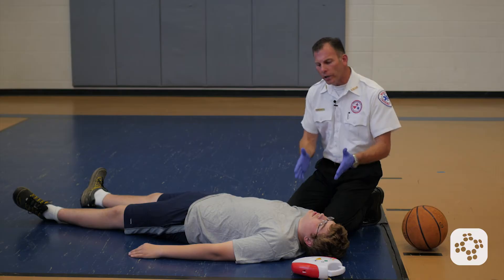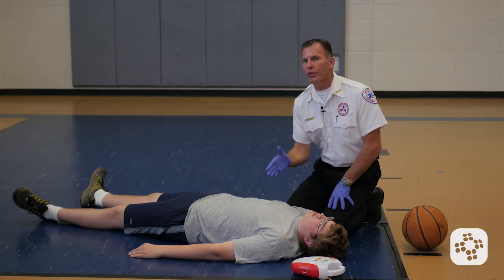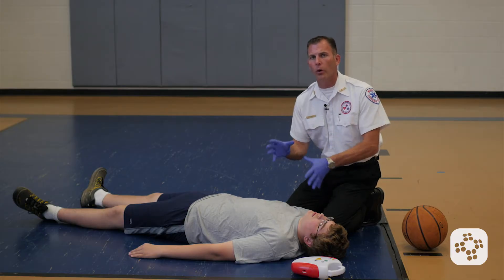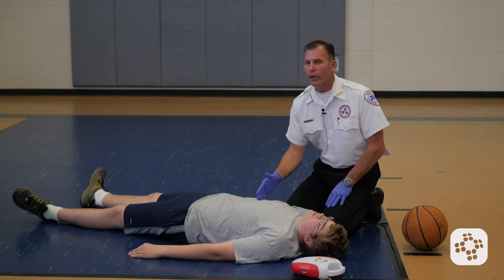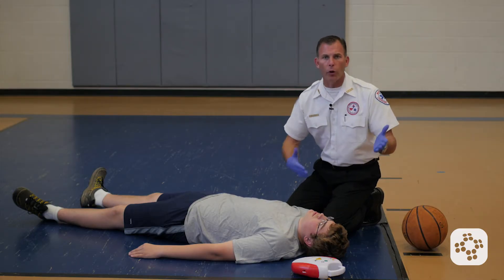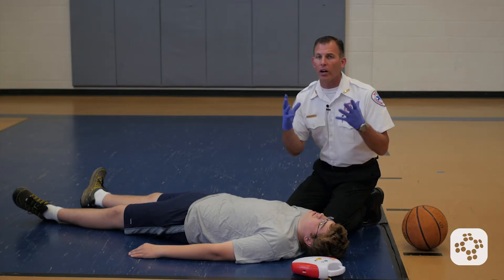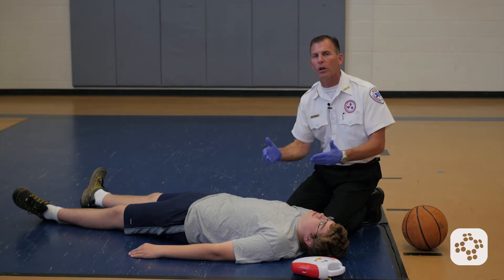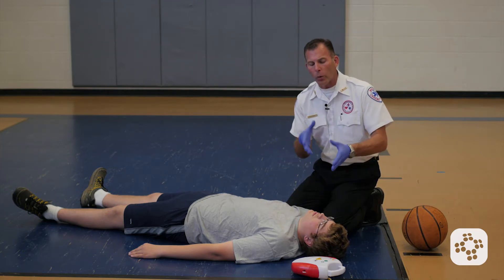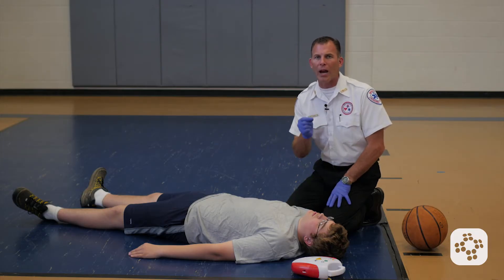Now let's talk about the skills required for use of an AED, but the patient is a 17-year-old teenager. They're going to fit in with our adult-level protocol when we use an AED, and this is very common. We've heard about it in the news a lot — kids between 14 and 18 years old, on the court, on the field, seemingly healthy individuals, and then they go down in cardiac arrest. This is the scenario we're setting up, showing how easy it is to get them the help they need rapidly.